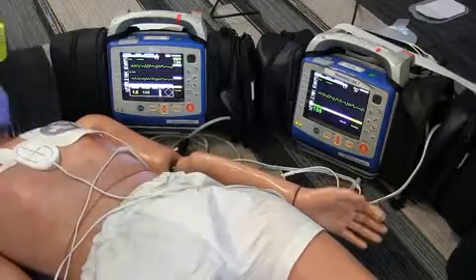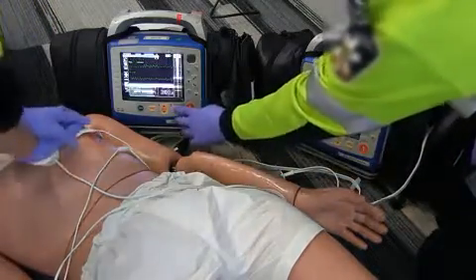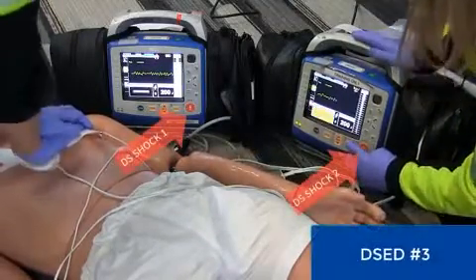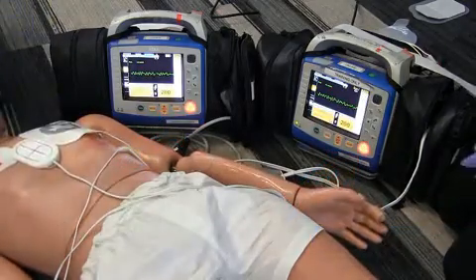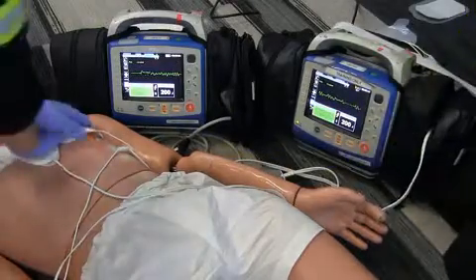Okay, stop CPR. Let's analyze the rhythm. Patient is still in VF. Continue CPR. Charge for the third double sequential defibrillation. Okay, stop CPR. I'm clear. You're clear. Everybody's clear. Shock one. Shock two. Continue CPR.